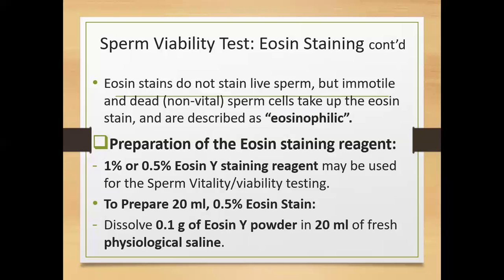Please try and follow the science behind everything that we're doing. And once it comes to its application, you should be able to apply it. Don't say, oh, we did this one when we were doing that, but it is still applicable here. So if you expose the sperm to water, there's something called hypoosmotic testing of the sperm, where the water will move into the sperm, and once it moves in, it will swell it.